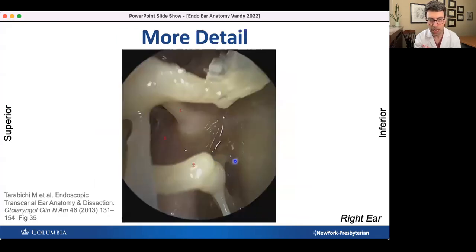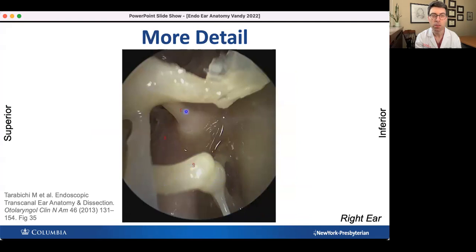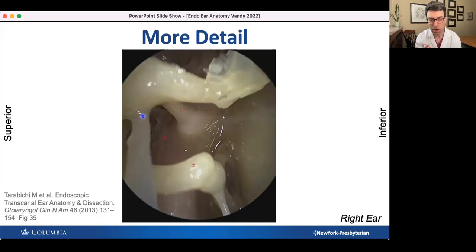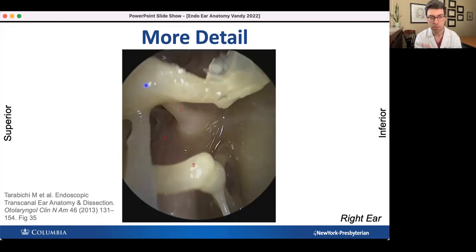Here's more detail zooming in on the stapes — we can now see its horseshoe-like appearance. The stapes has an anterior crus and a posterior crus, and here's the stapes footplate. The stapedius tendon attaches to the stapes neck. We can see the tensor tympani inserting into the neck of the malleus, and here's the chorda tympani nerve. Sometimes when you first raise the tympanomeatal flap and see an ossicle, you don't know whether it's the incus or malleus. If the chorda tympani passes lateral to it, it's the incus; if medial, it's the malleus.